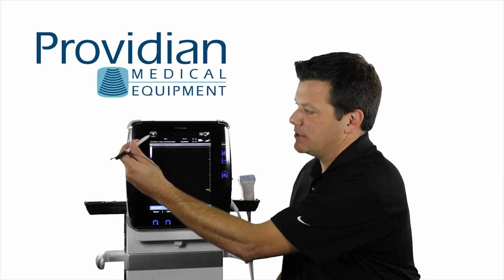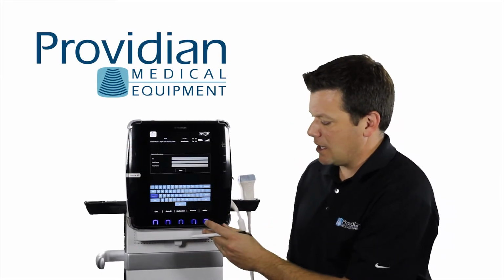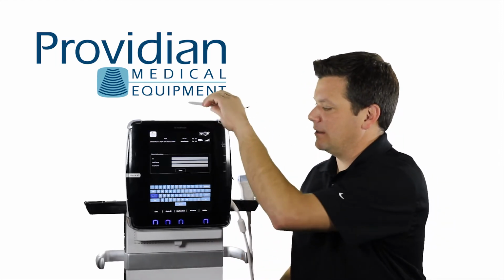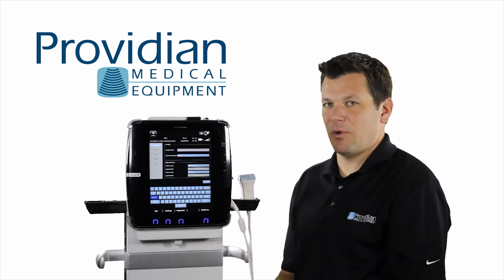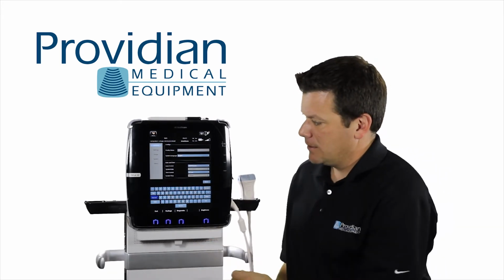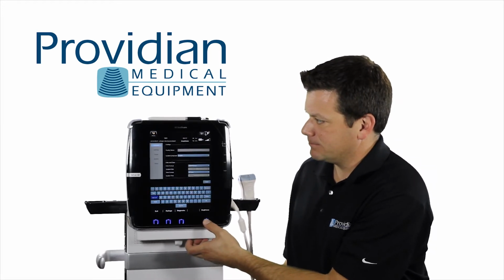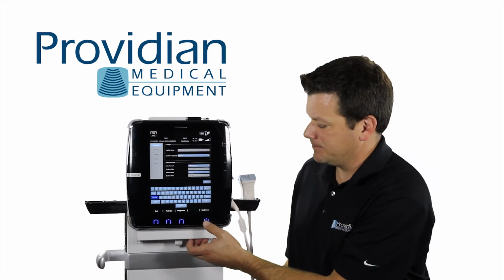Now let's go back to the patient and see what else we can do here on this setup screen. We already saw the utility, but there's some more things in there that I'd like to show you. We can set the screen brightness, which is very important in setting up the machine. You hit the brightness, keep hitting it, and we'll go through the different brightness settings.